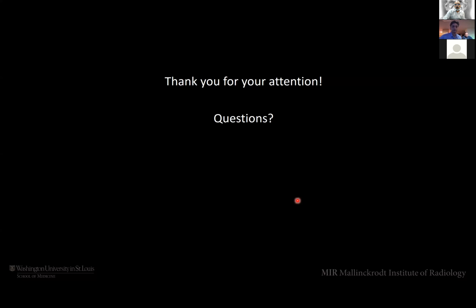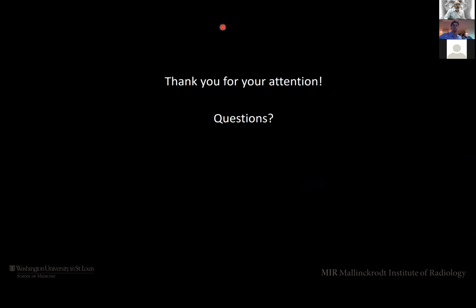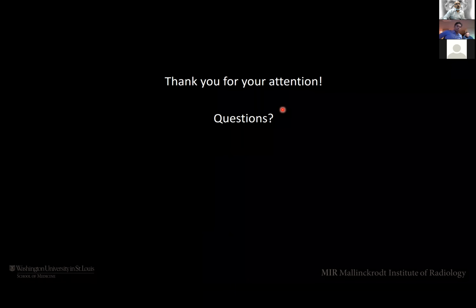Thank you. I request whoever is there in the audience to send their questions through the chat box. In the meantime, I would want to ask Vamsi a couple of my own queries. One was, you said you are doing a multi-echo GRE sequence for iron quantification in the liver. Yeah. So I have a doubt here.